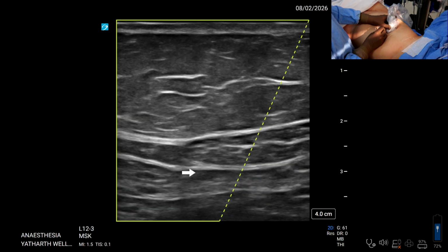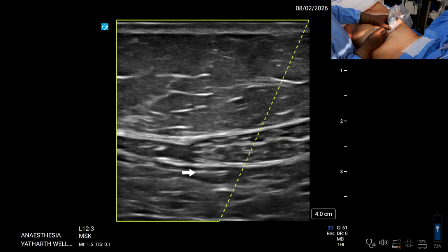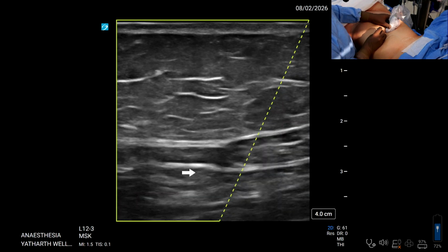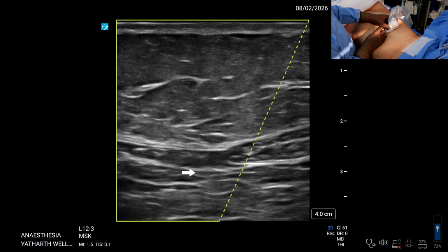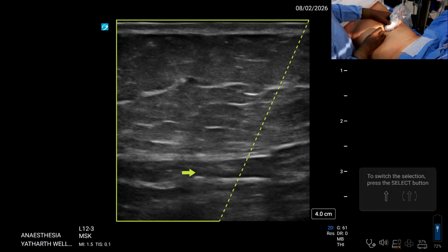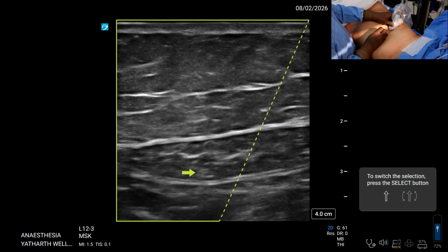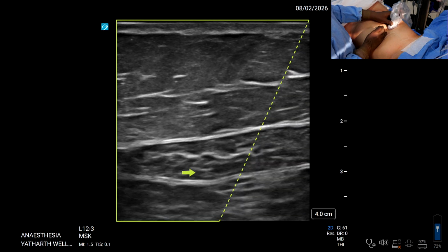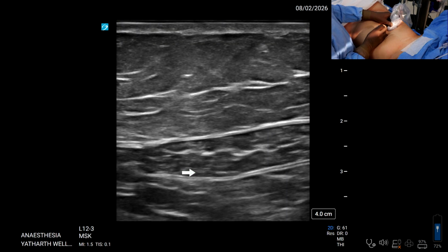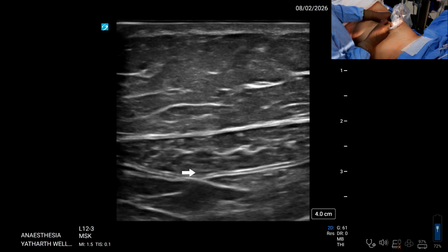Reverse. Yeah, I am coming from medial to lateral. Okay, so you're giving the right side block first. Yeah. You can remove it. Can we remove the SMPE profile? You can remove it. Will you tell this aloud to the audience later? Right now it is creating a distraction. Yeah, thank you.